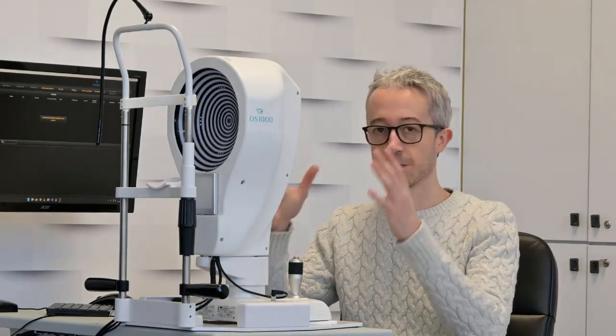Hi, today we are gonna talk about the corneal topographer. The device is composed of the main body, including a base, a plate, and a chin rest.